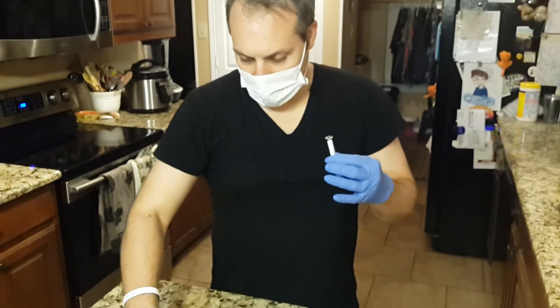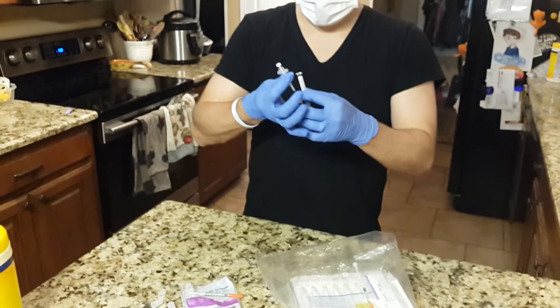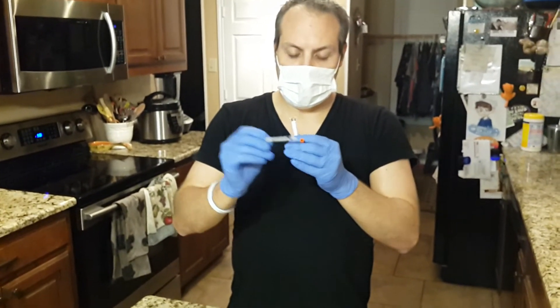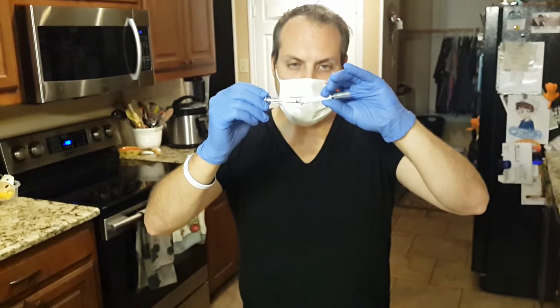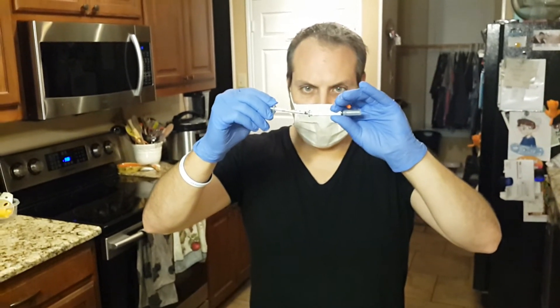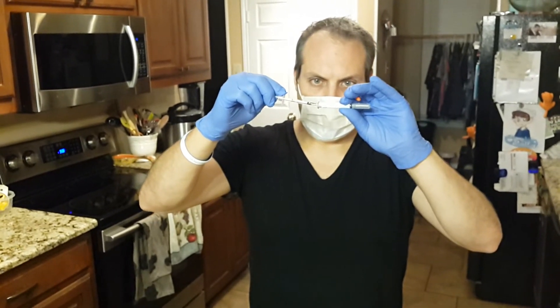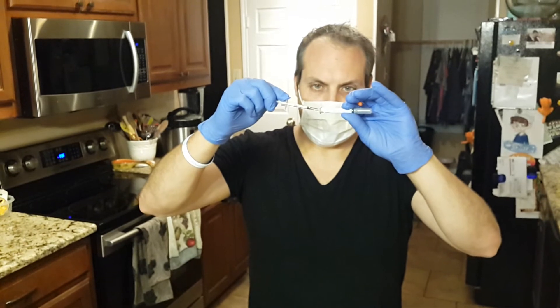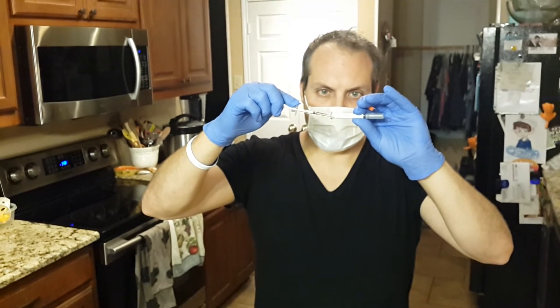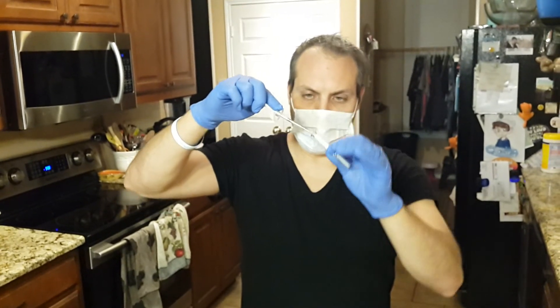There's probably going to be a small air bubble there so I'll have to deal with that. I take the cap off again and loosen it up a bit because sometimes it gets too tight. You need to find an angle where you can actually see the liquid inside, and get your needle right into the back end of the syringe. Drawing up to 0.25 mls on this second one.